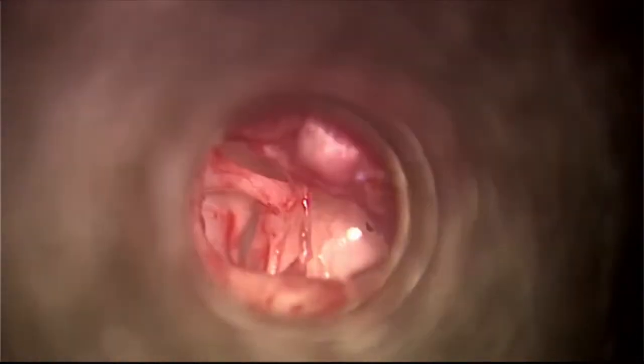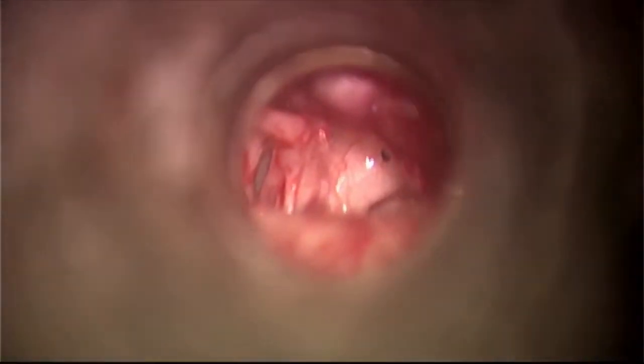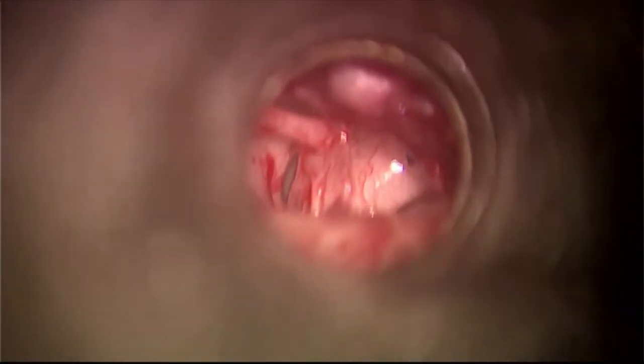The reason is, for maneuvering your piston, you need space. It is not that this is mandatory. Like Mubarak was saying, in endoscopic surgery, if you are doing it with the endoscope, you don't need to remove overhang, because you have a panoramic view and you don't need a lot of space to maneuver your instrument when you are coming with the endoscope.